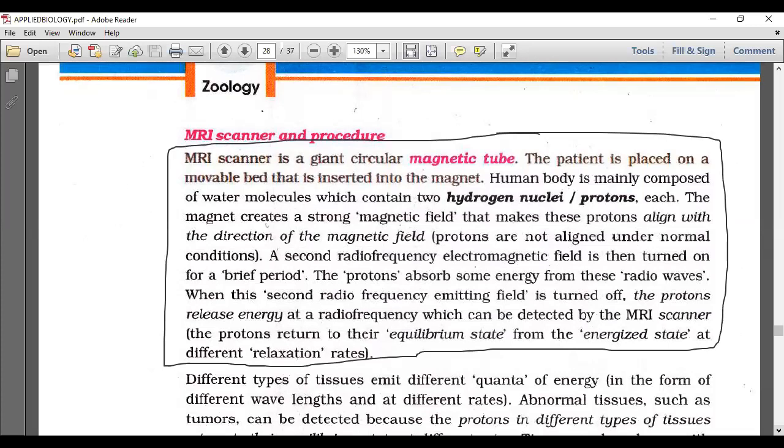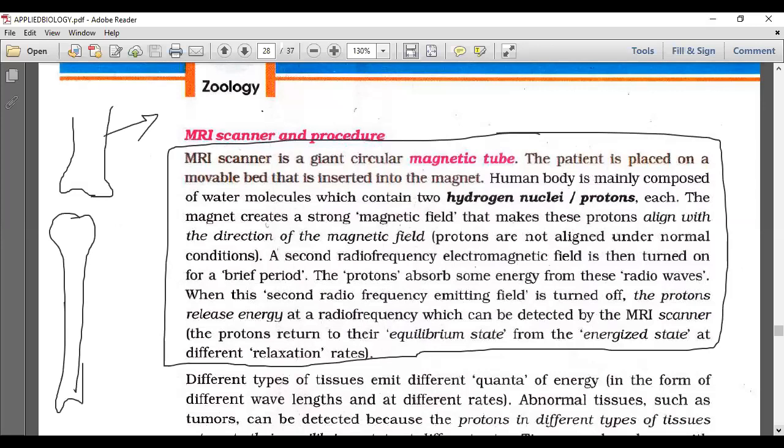So do remember, this is the work of doctors. Simply what we can say here, if you know the normal condition, for example, this is a normal condition, this is the humerus, the upper one, and this is the radius and ulna, and this is the joint. So when we take an X-ray, MRI or CT scan, and a crack appears here, you observe a small crack.